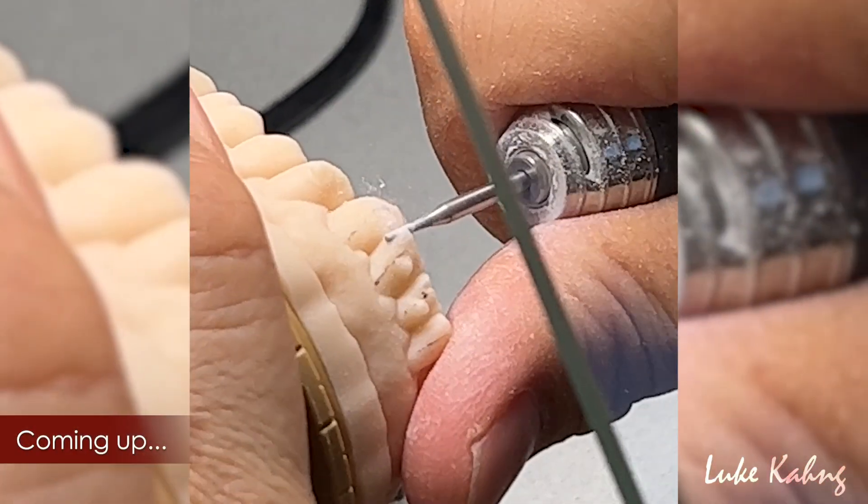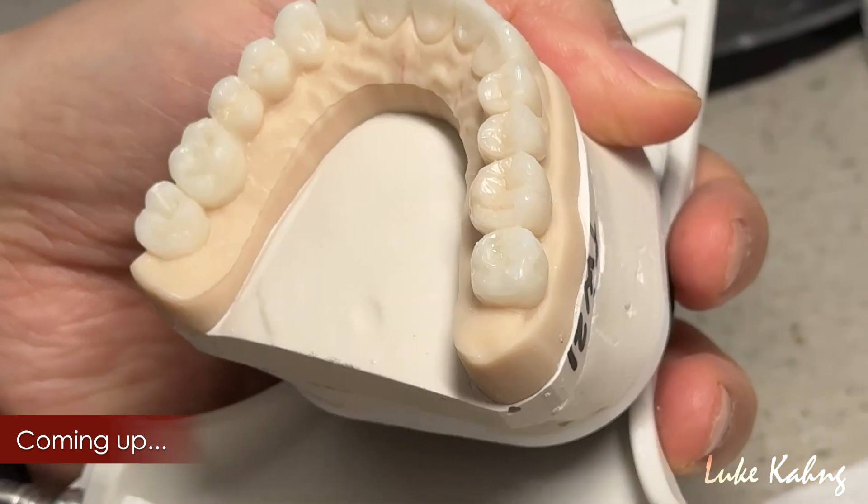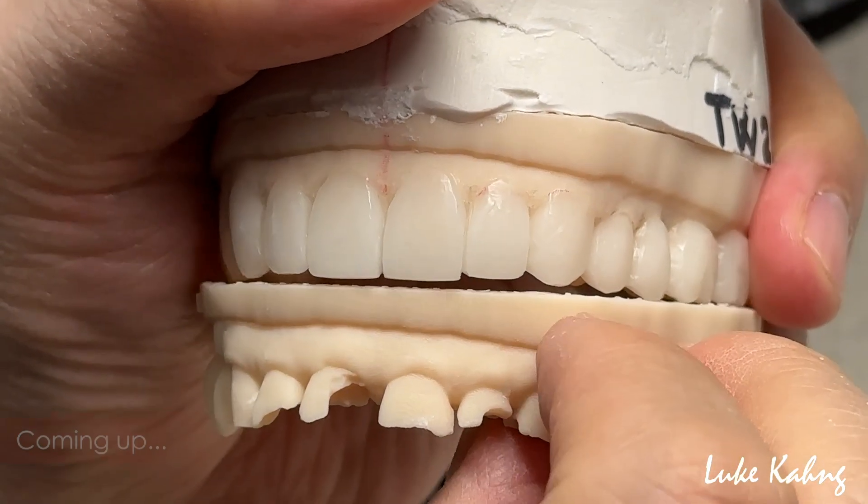Finish with the zirconia restorations and we follow the trimmer plan provision. Huge differences between before and after.